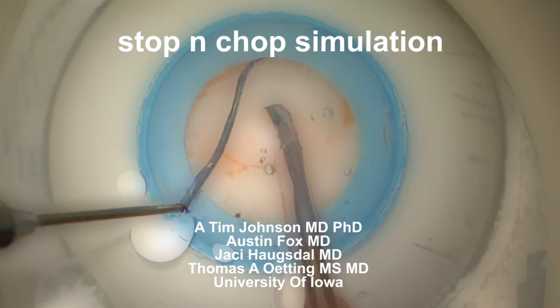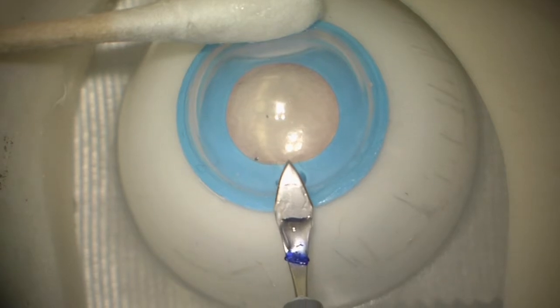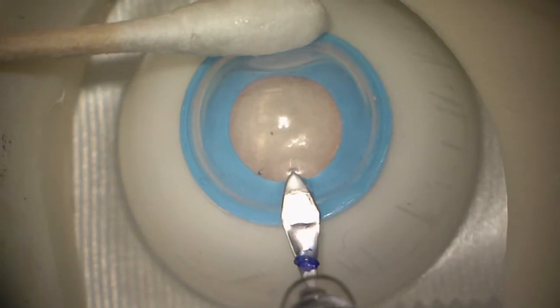Hi, this is Tom from the University of Iowa. I'm going to show you a great way to simulate stop-and-chop using these PS12 eyes from Craig Phillips out of the UK.